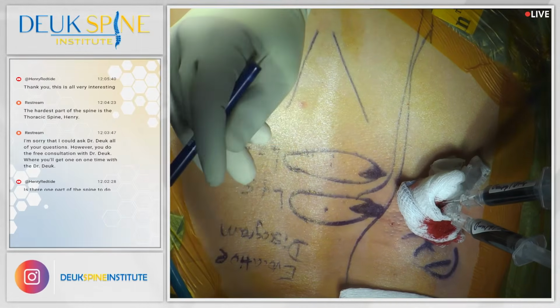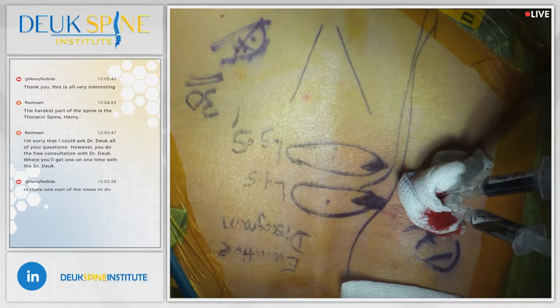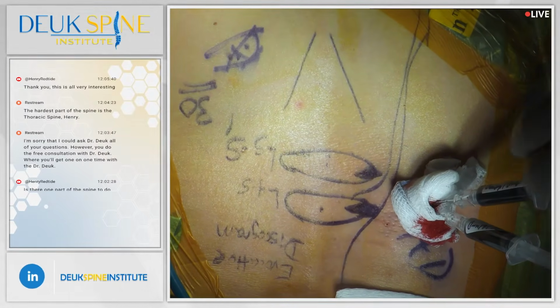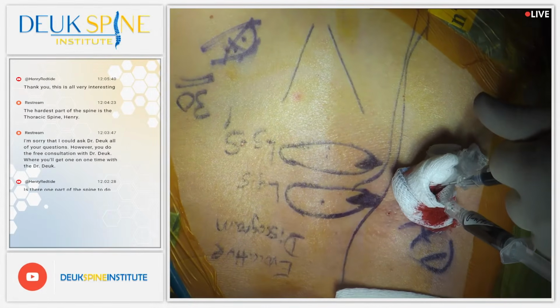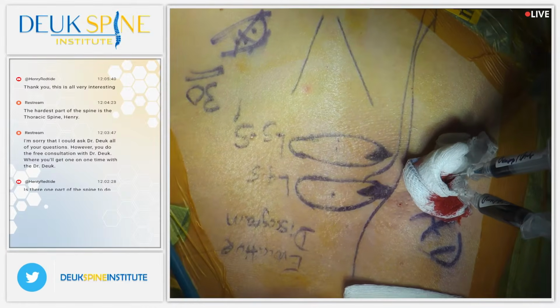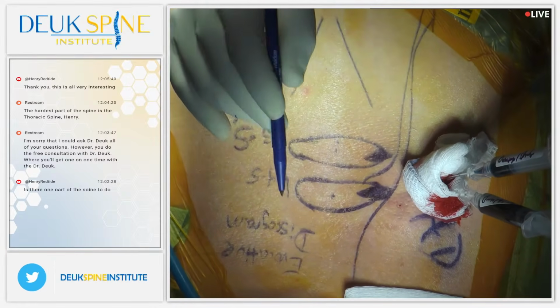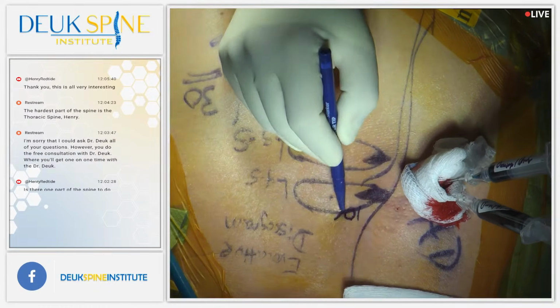Are you having any pain? Are you having pain right now? No. All right, that's good. You're doing great. How bad is that on a scale of 1 to 10? How high? Give us a number. What's the highest it went? 10. I heard you. She just said 10. And is that where you get your back pain?